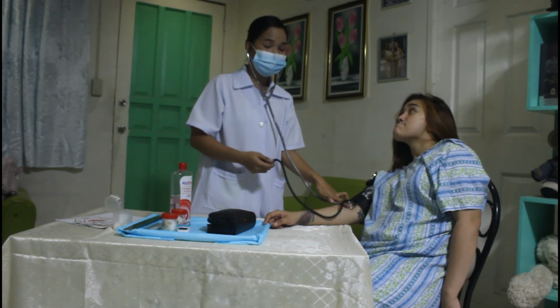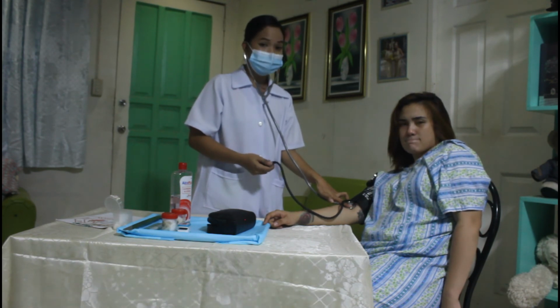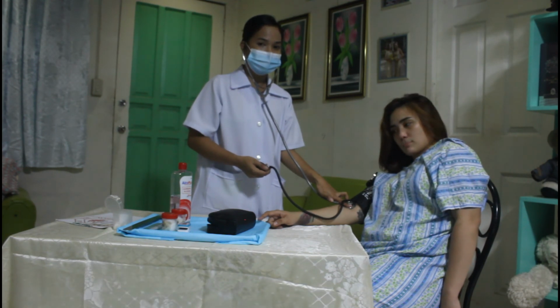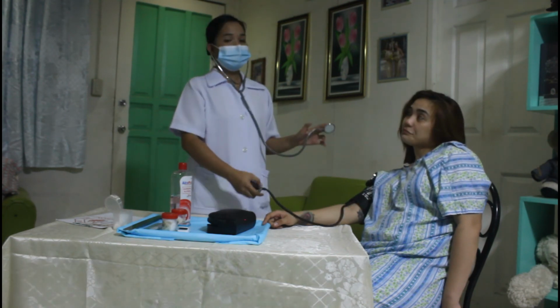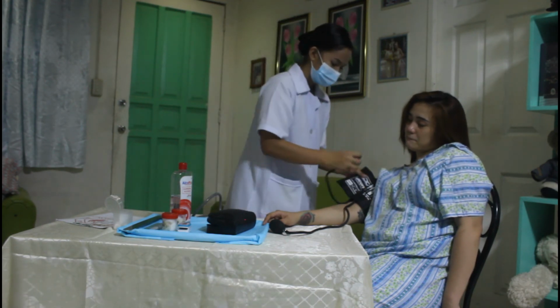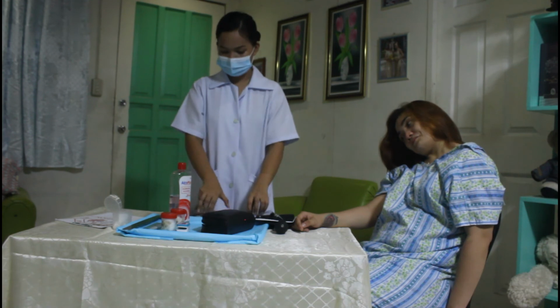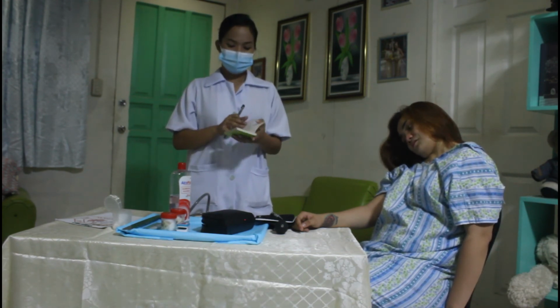And while gradually deflating the cuff, then note point at which sounds disappear. So, that will be the sound that reflects our diastolic pressure. So, once we're done, then we take note of the blood pressure of our patient.